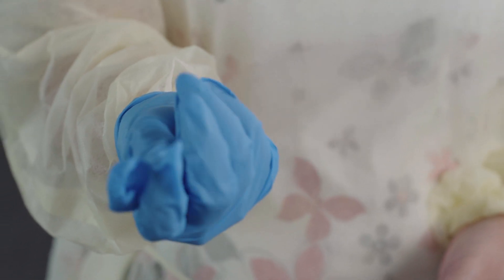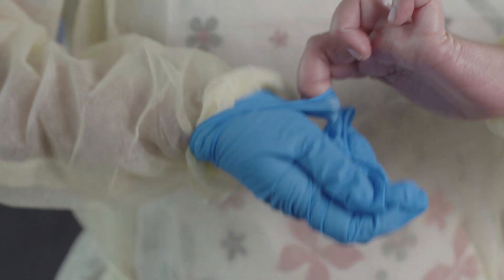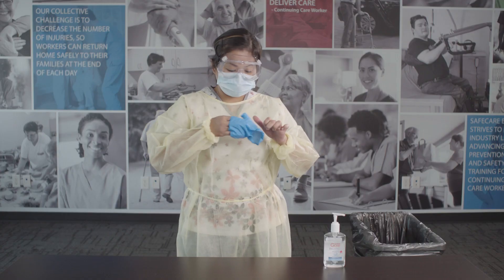Slide the fingers of your ungloved hand under the other glove at the wrist. Touch only the clean part of your cuff. Peel the glove off, turning it inside out with the other glove inside.